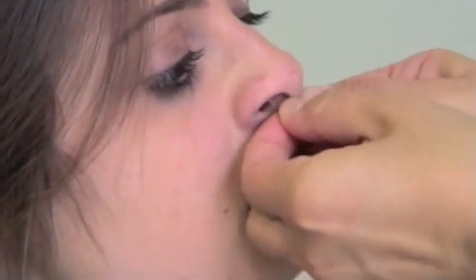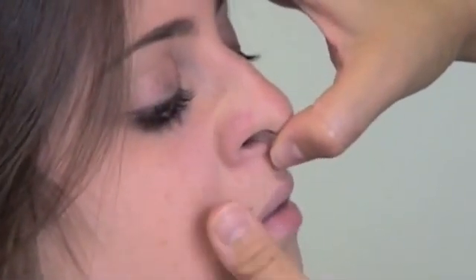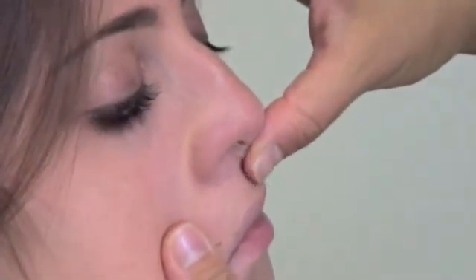This device, made of soft material, is easily introduced into the nose to modify in a physiological way the valve area.